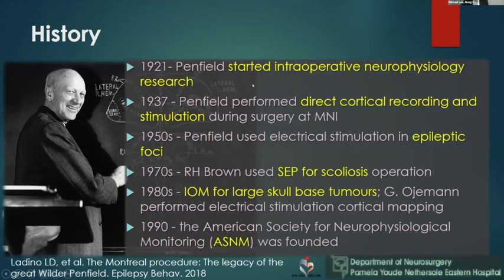The real intraoperative monitoring actually starts with Wilder Penfield. He started his intraoperative neurophysiological research in 1921 and did direct cortical recording and stimulation during surgery at the Montreal Neurological Institute in 1937. And then Professor Brown did somatosensory evoked potentials during scoliosis operations in the 1970s.